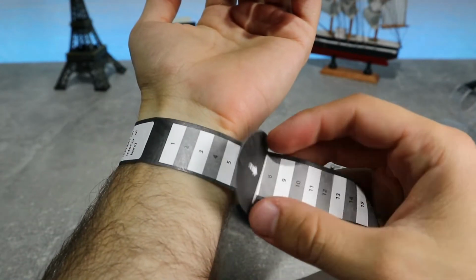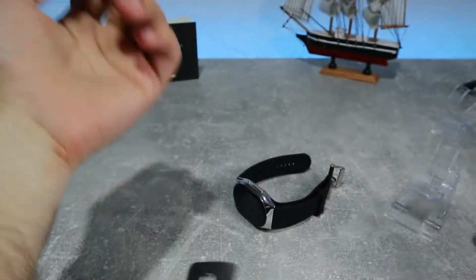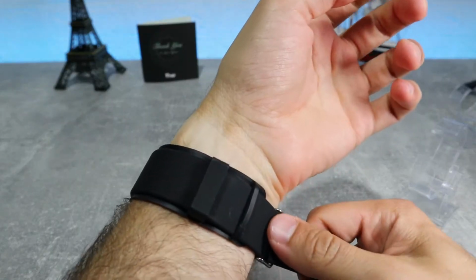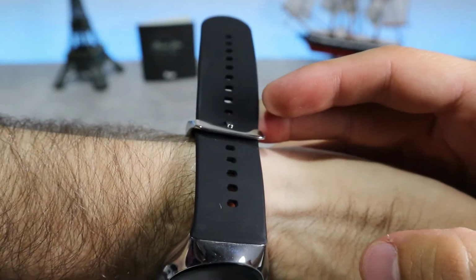Before starting the measurement, the watch should be about 2 fingers away from the palm and feel fit around your wrist. It's very important that the watch be placed at heart level, so you can either place your arm against your chest or on a box such as a watch's package while sitting at a table.